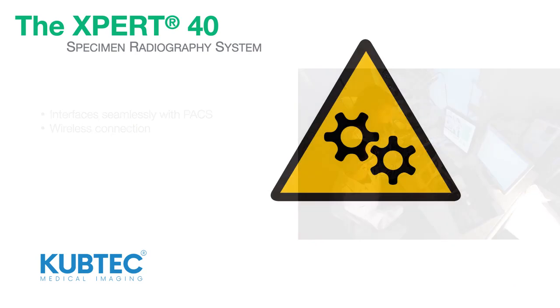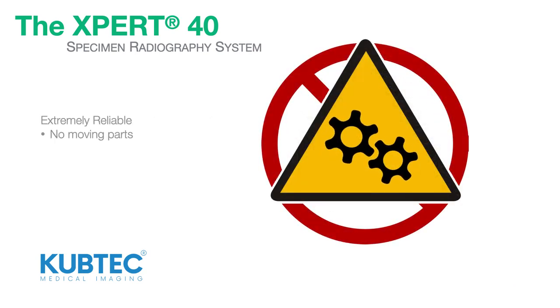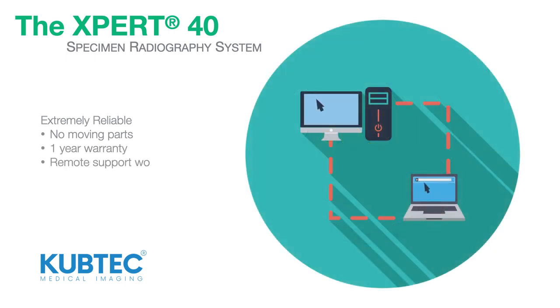The Expert40 is extremely reliable and has no moving parts. What's more, every system comes with a full year's warranty and remote support worldwide.